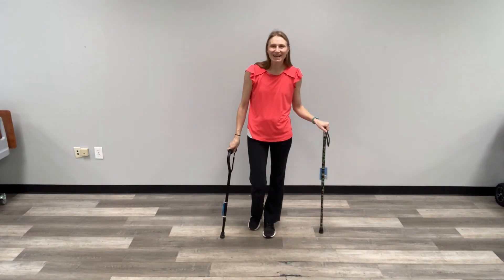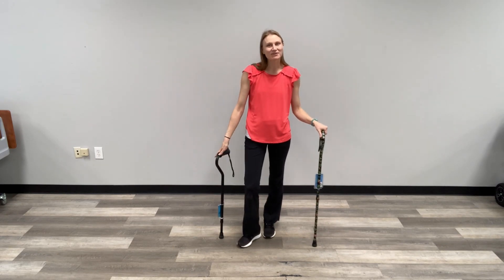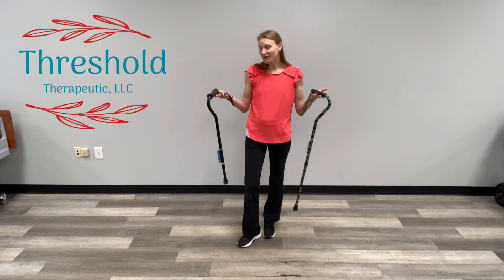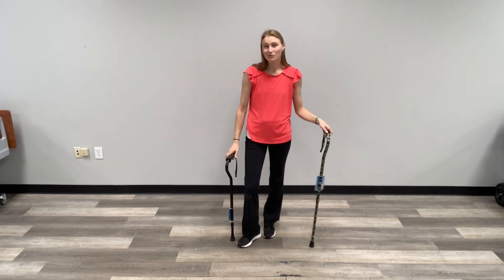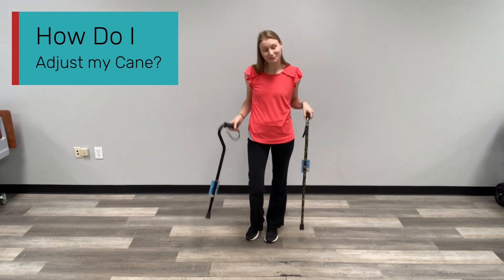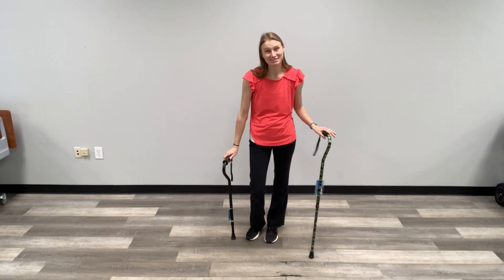Hello everyone, my name is Maddie. I am an occupational therapist and owner of Threshold Therapeutic. Welcome to the Home Care OT. We are here to answer today's question, which is: how do I adjust my cane? I am not here to do a song and dance for you with my canes — let's talk about how to adjust them.